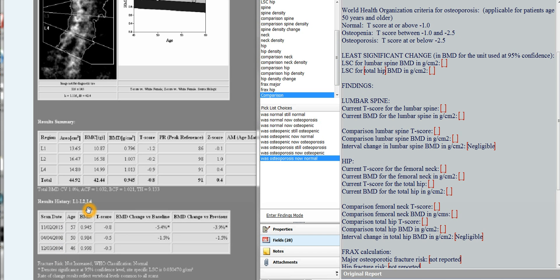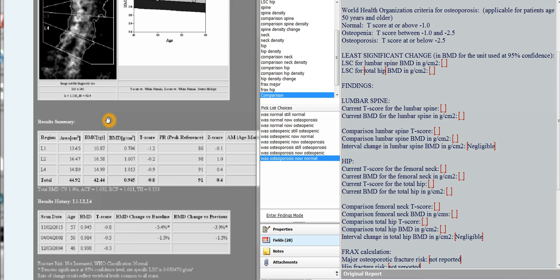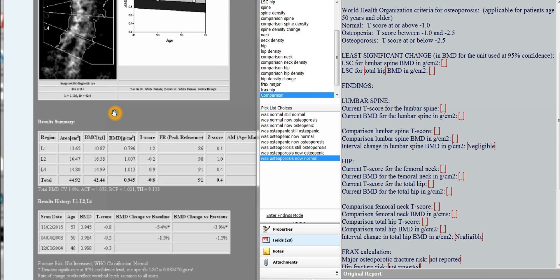There are two areas that you use for comparison. One is the lumbar spine, and the other is the total hip. In this case, we'll look at the lumbar spine. So here's the results summary for the lumbar spine, and then here's the results history where there's a comparison table. I picked this case because it has a lot of degenerative sclerosis, and I wanted to show the difference between a statistically significant change versus a clinically significant change. We're just going to discuss how to do the statistically significant change, and then we'll show that maybe it's not clinically significant because of all this sclerosis that has developed in the interval.